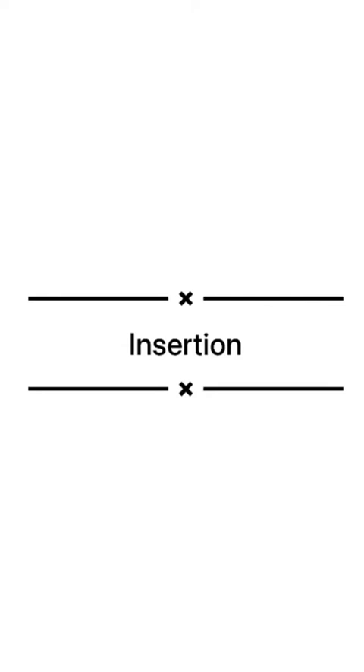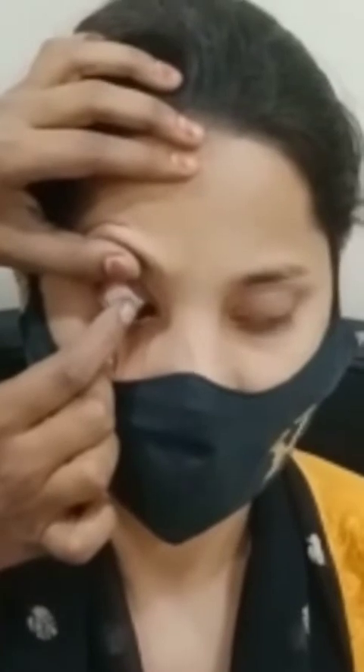The third step is insertion. Ask the patient to look straight at a given target. Hold the upper lid of the patient with the thumb along with the eyelashes and hold the lower lid with the middle finger. Ask the patient to look away and then put the contact lens on the sclera. Then ask the patient to look in different directions and close the eye.